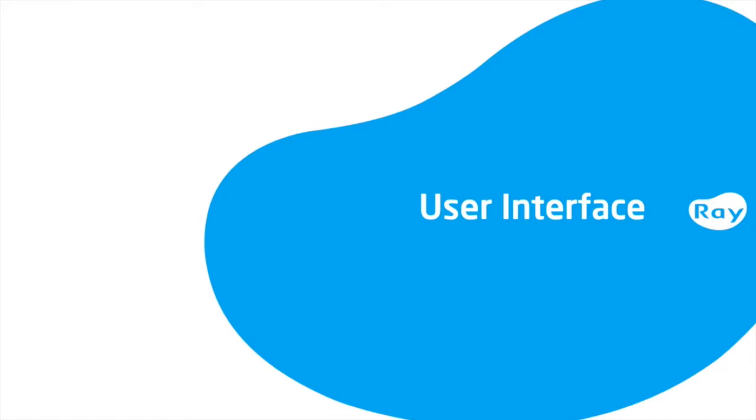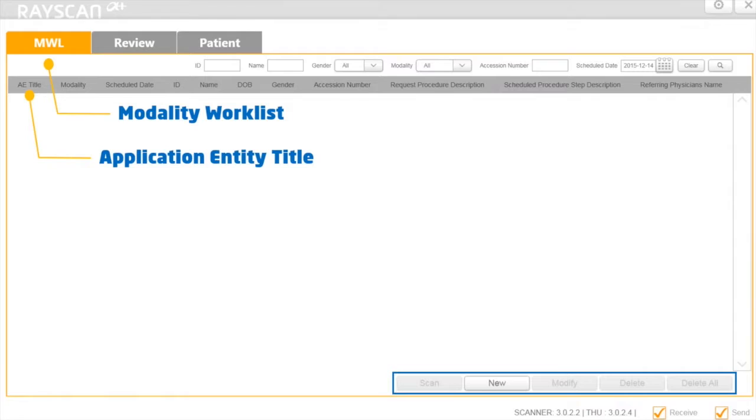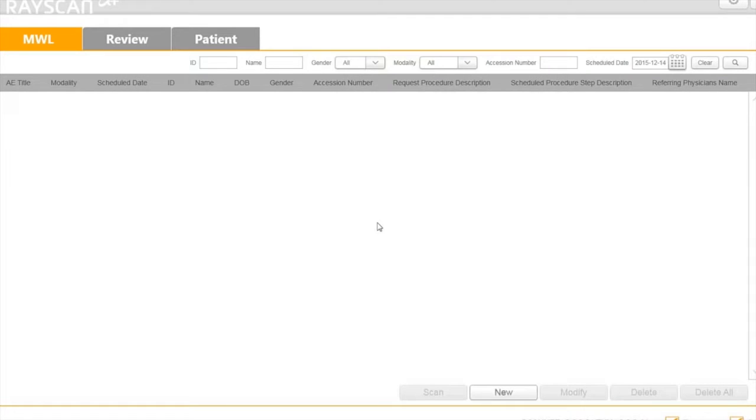Let's dive right into the RayScan software. Once you launch RayScan, MWL is the default tab.